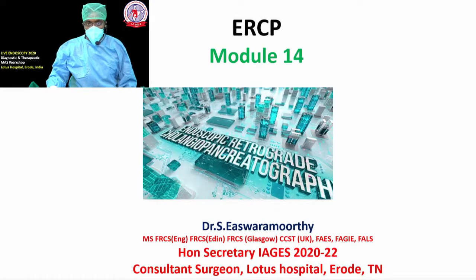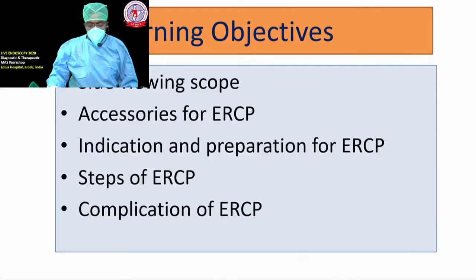Once you know that, then we'll go and see a patient where all the steps are carried out the way we are going to describe now, followed by another case to emphasize the same thing which we learned. So that is the aim of this particular module. Let me take you through this.